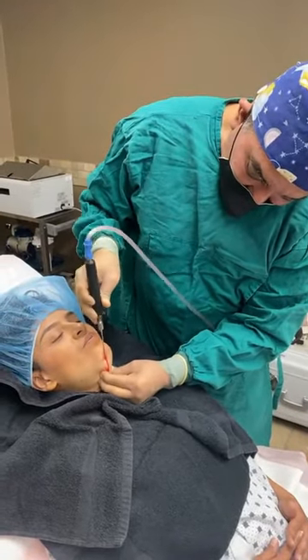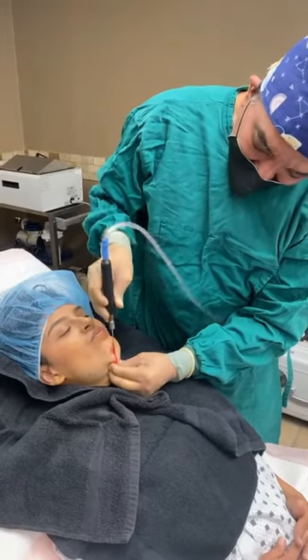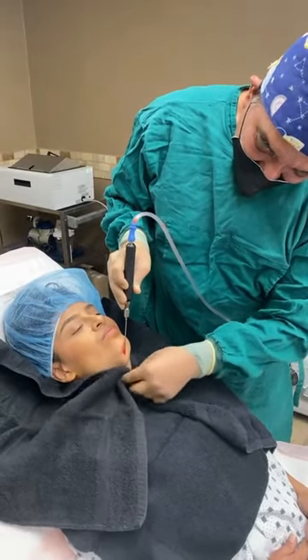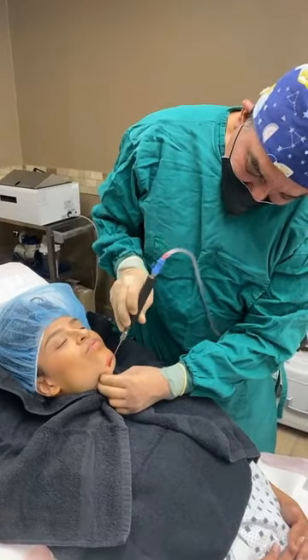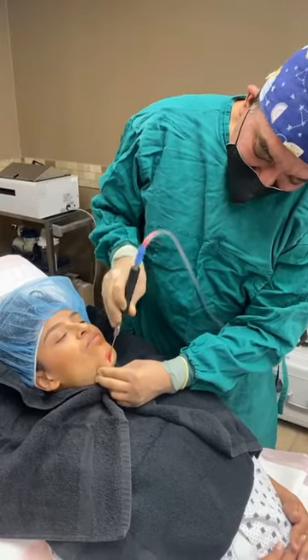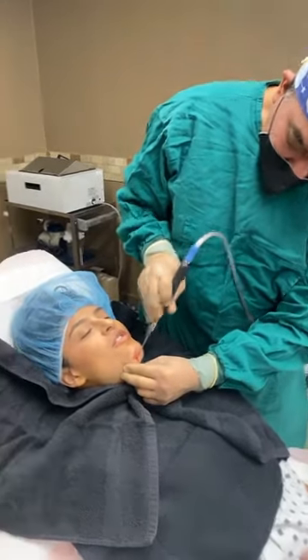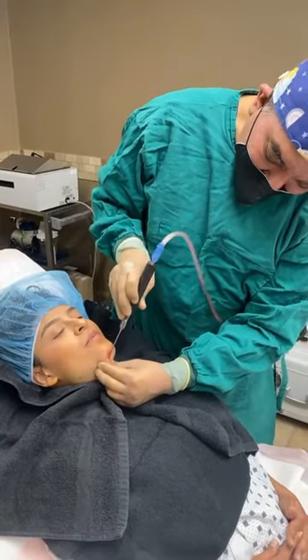And I'm just going to pull this a little bit forward. We don't want to hit her Adam's apple, even though it's a cute little one. You don't want to damage it. Again, I lift up all this tissue so that it makes it easier to avoid any underlying structure issues. And in some cases, maybe same day consult. Same day lipo.